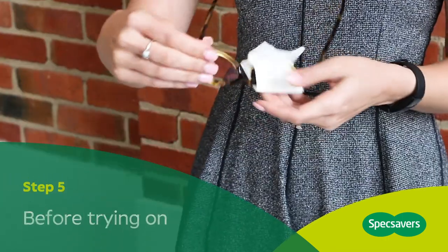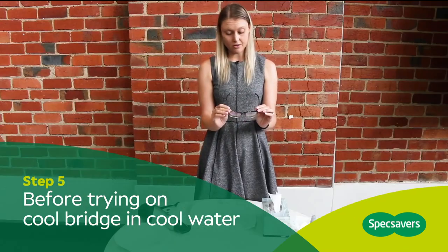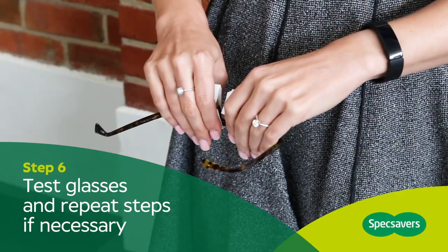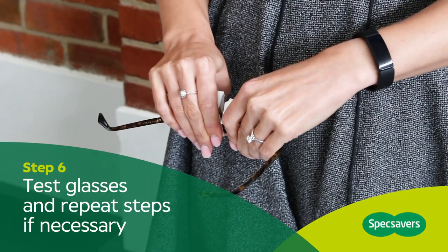Remove the tissue from the lenses. Cool the center of the frame down in some cold water, and finally try on your glasses — they should be straight.